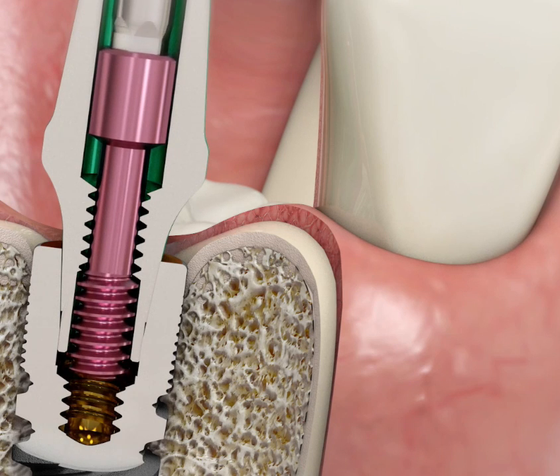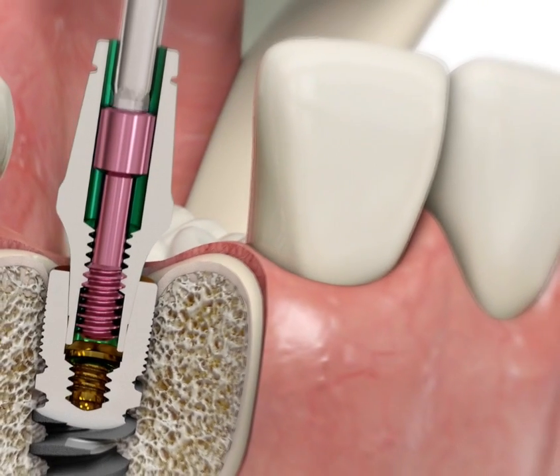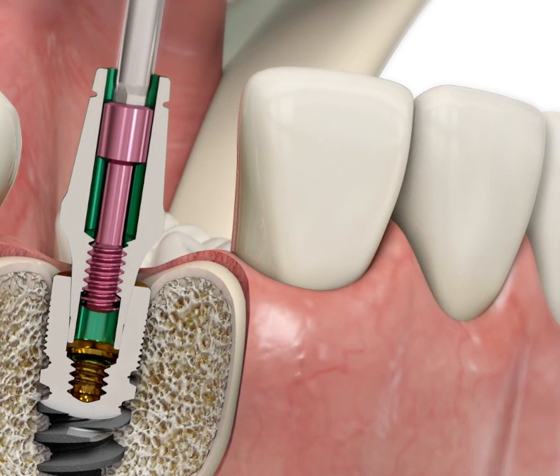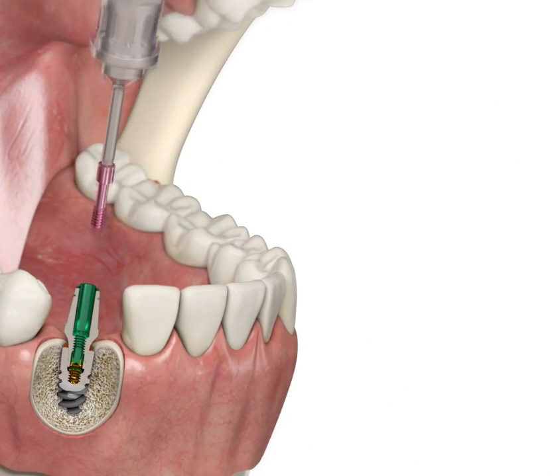Once you can feel that the screw is in between the implant thread and the superstructure thread, gently pull up on the screw to continue unscrewing it through the superstructure thread. Remove the screw from the mouth and put it in a suitable place.